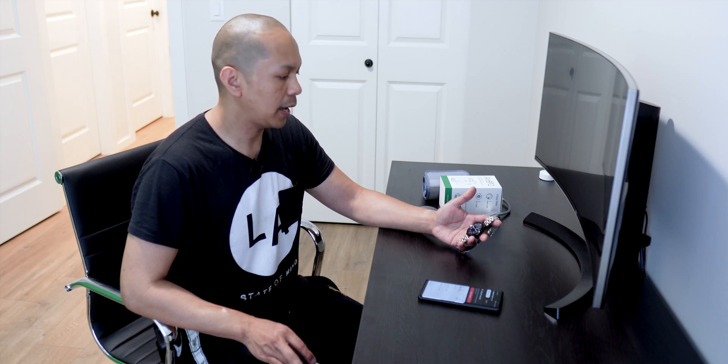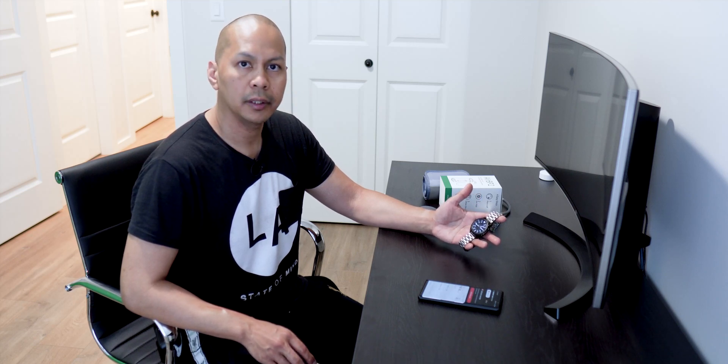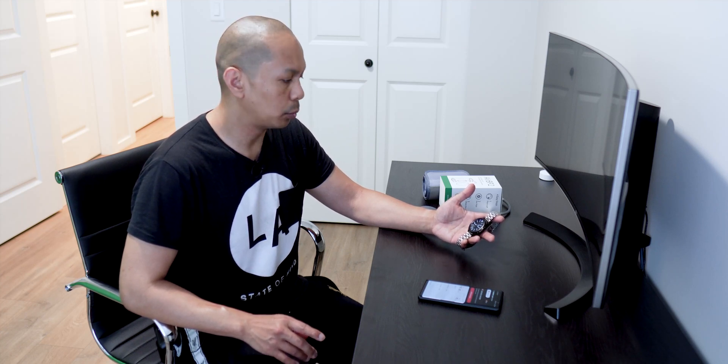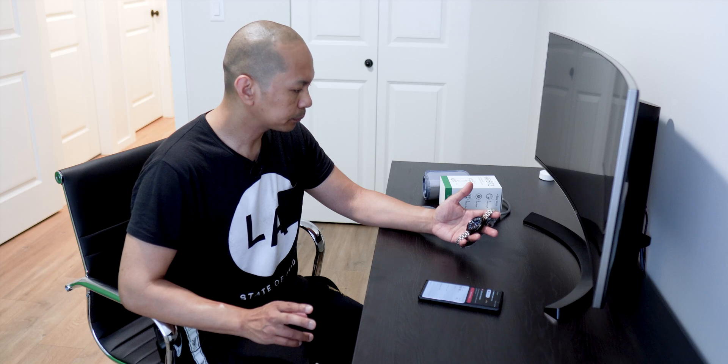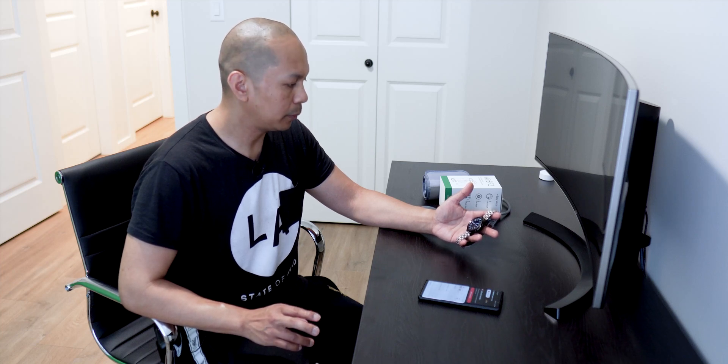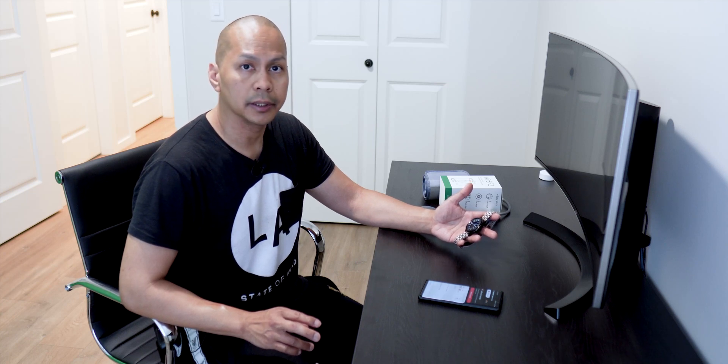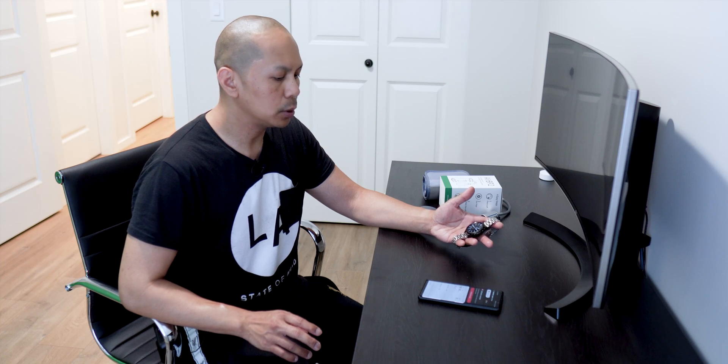Hey guys, it's Lam here again, your tech guide. In today's video we are going to be checking out the blood pressure app on the Watch 3. It's been a while since I haven't been using it, so we're going to try to use it and at the same time check the accuracy. The first thing we have to do is calibrate it.